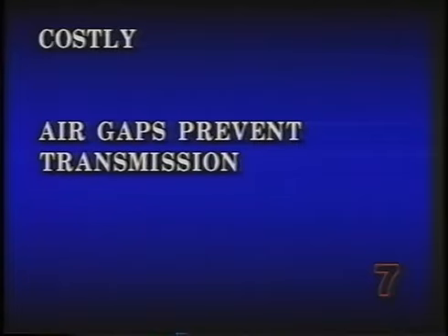As with any instrument, ultrasound has some limitations as well. The first is that if one were to actually buy an ultrasound machine rather than affiliate with a local hospital, it can be a rather expensive purchase, as much as $200,000 for a sophisticated machine. A second and more important disadvantage is that ultrasound will not jump an air gap, so that while we can get images of the surface of the tongue, we don't, in the normal course of events, get images of the palate or the posterior pharyngeal wall. And sometimes we don't see the tongue tip as well because there is air beneath that.